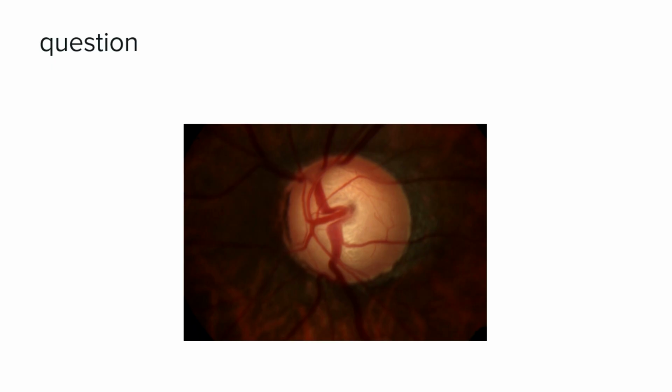Then, ma'am, how's the rim? Ma'am, there is thinning of the rim. Where? Ma'am, superiorly there is thinning. More or less all around, yeah, there is thinning 360, in all quadrants. So what is that called? What term do you use for that? Ma'am, loss of neuroretinal rim. Uniform thinning there is, yes, no? Yes, ma'am.